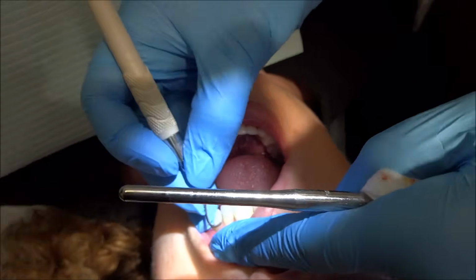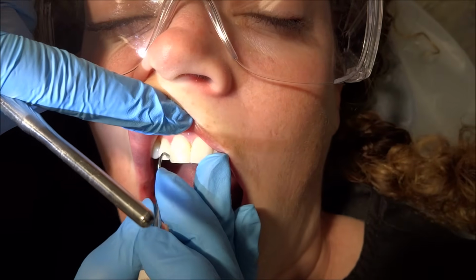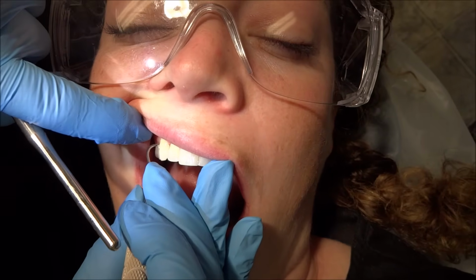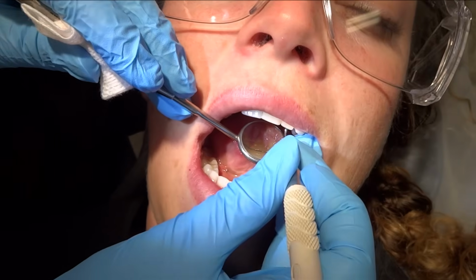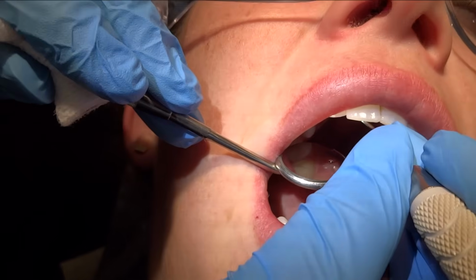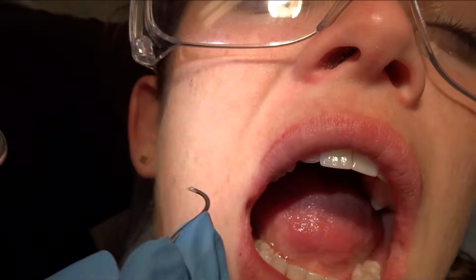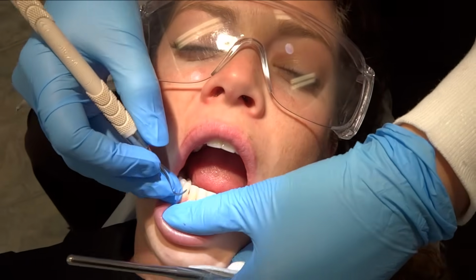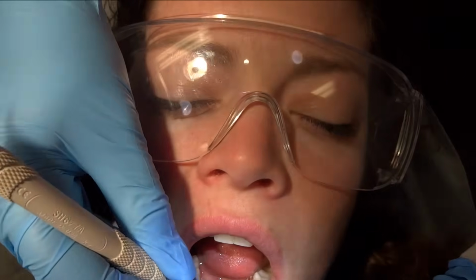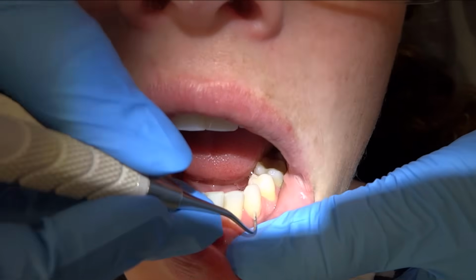Now I'm going to do the maxillary arch. Some areas I don't use a hard activation stroke because I'm using an exploratory stroke, and if I feel something, then I'll activate it. Then we'll move to the linguals. Then I'm going to switch up to 12 o'clock and we'll do all the surfaces away on the anteriors. I'm using that finger assisted stroke with the back of my thumb.